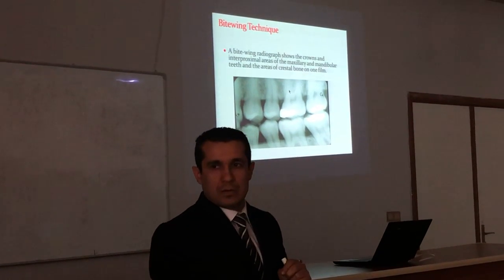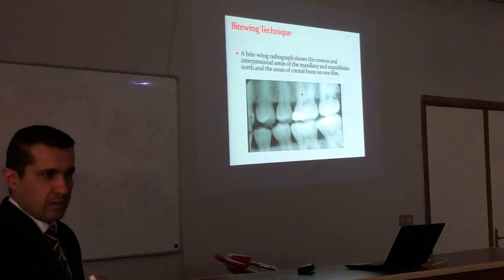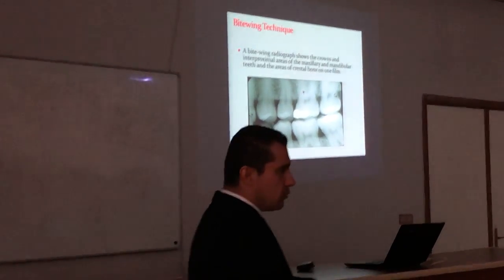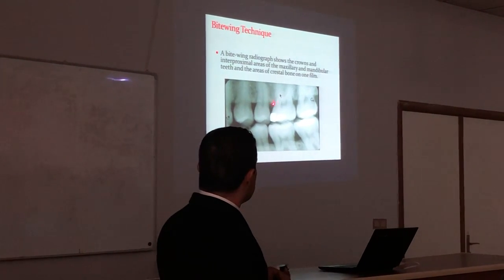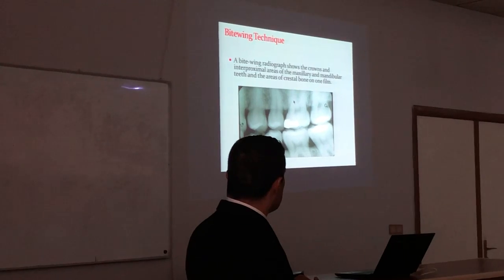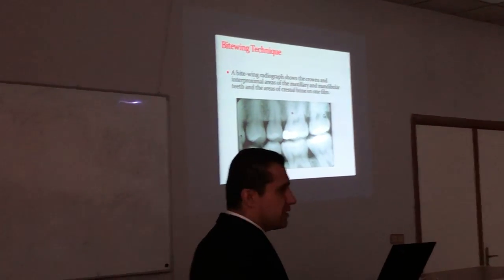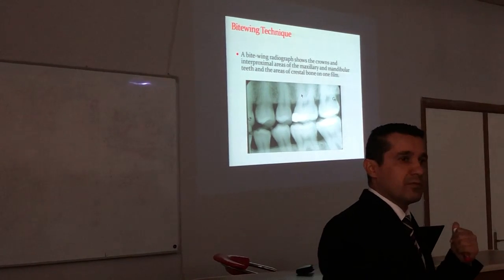Not caries, in the bone there is no caries. Pockets. Exactly. If you have suprabony or infrabony pockets, you see that there will be a resorption in the area. Like in this area, you see it's more than normal. You can detect that even the pain may not be from the tooth; it may be from the pockets.